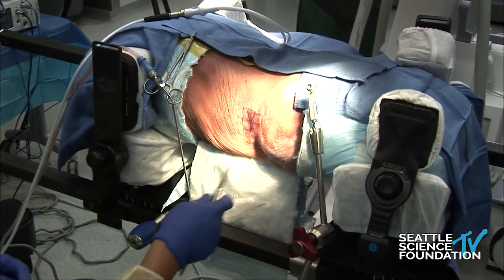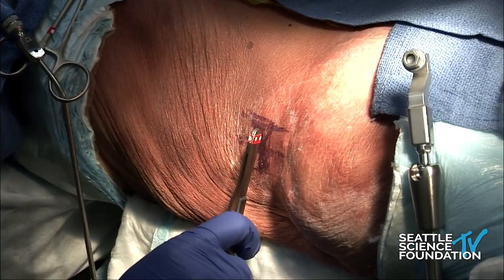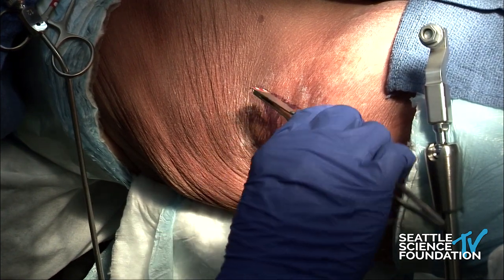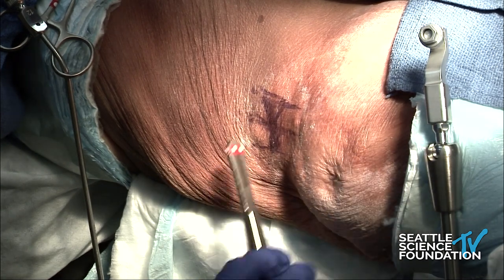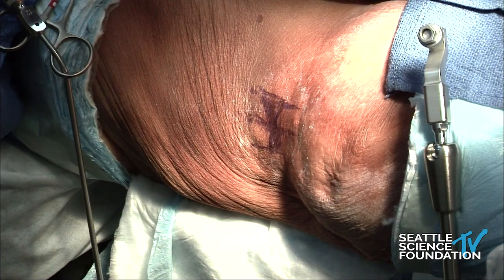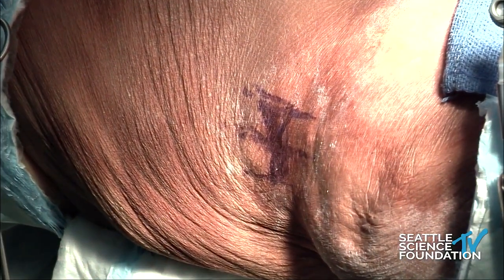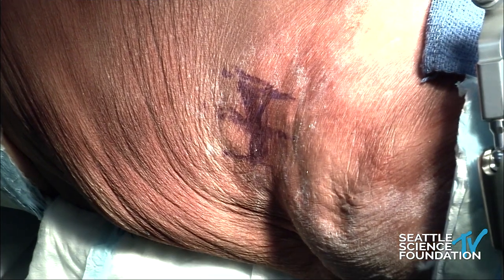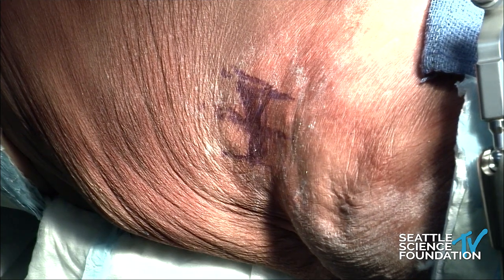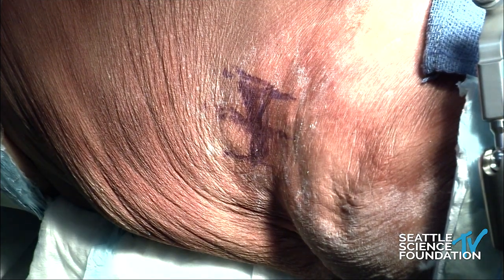I've marked out the patient here — I still do this with fluoro, kind of an old-fashioned way of doing this. I've pre-marked the vertebral body, here's roughly the midline, and then the posterior border and anterior border of the body. With an oblique incision like this, maybe two and a half to three centimeters is all you really need. We're going to do L3-L4, and we'll show you one of the ways of doing the prone lateral. It'll be great since we have Bill showing us the PTP later, so it's good to see multiple ways of doing the same procedure. I'll take the knife to make our incision.